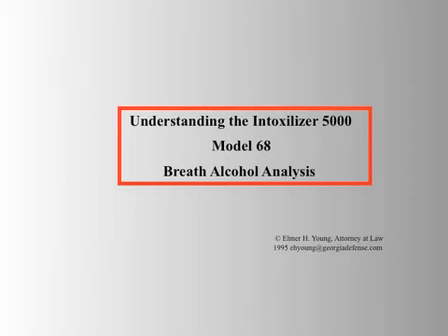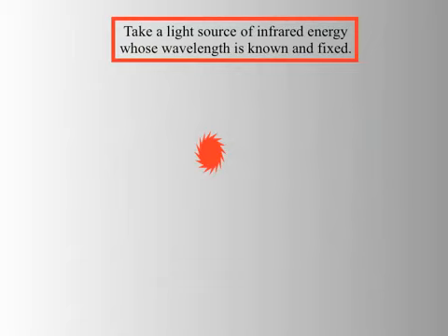The theory behind infrared photochemical breath testing is simple, and this slideshow, put together by Elmer Young, a Georgia DUI defense attorney, explains how the Intoxilyzer 5000 Model 68 breath alcohol analysis machine works. Essentially, the Intoxilyzer 5000 breath test machine measures light.